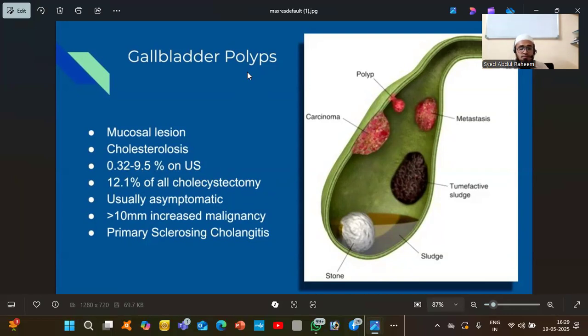Or we have another scan if the patient has chronic cholecystitis. Okay. Not gallbladder polyps or gallstone, or related to the gallbladder, we want to know exactly what the reason is. That is the HIDA scan.